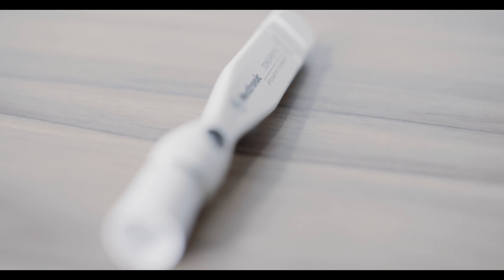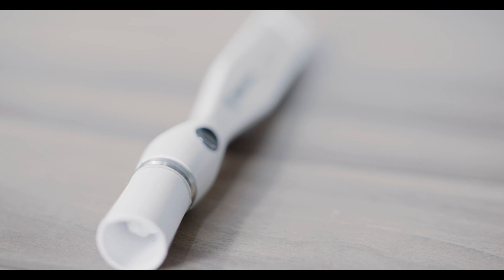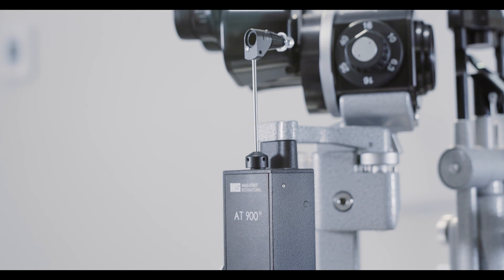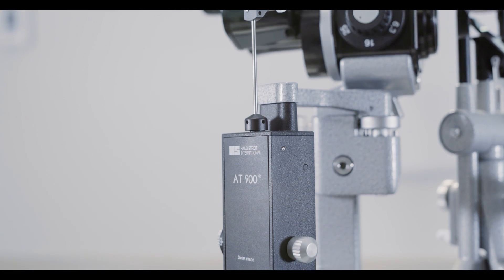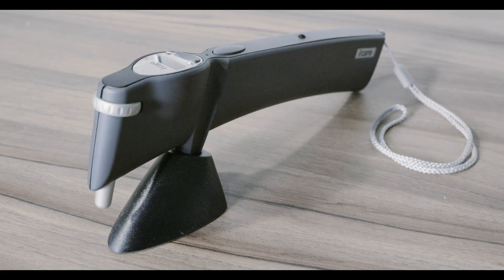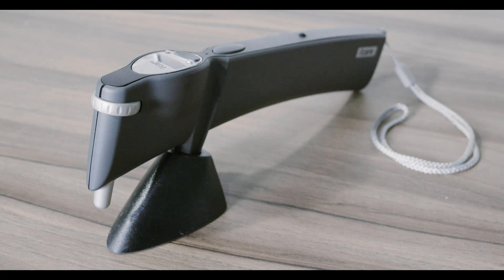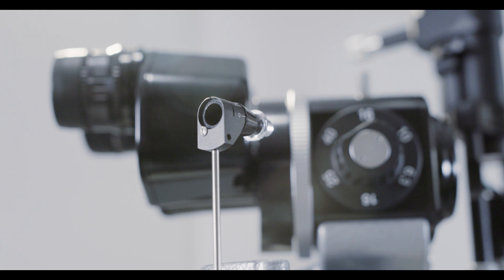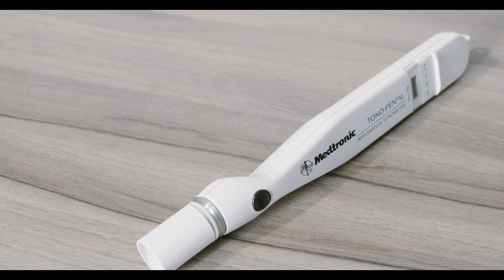The first is the Tonopan, which should always have the disposable cover exchanged between patient examinations. The second is the Goldman Tonometer, which is mounted onto the slit lamp. There are also newer devices such as the eye care tonometer, which allows for IOP measurement without the need for topical anesthetic. While the Goldman Tonometer is more accurate, the Tonopan is easier for new learners.